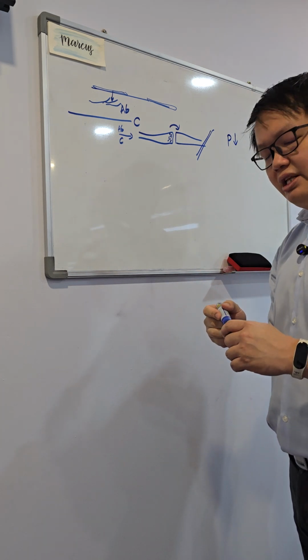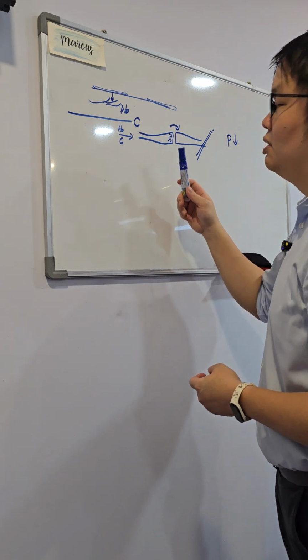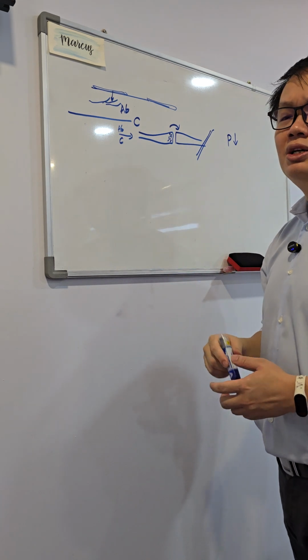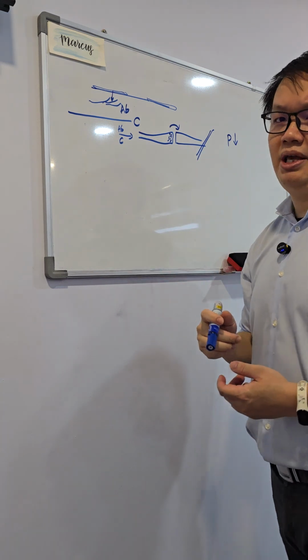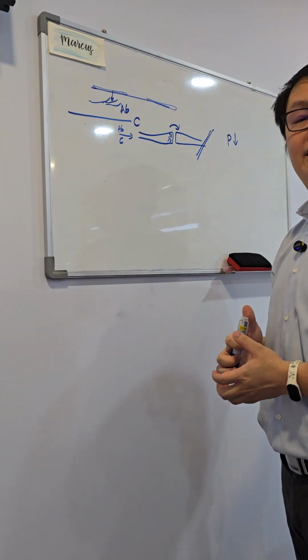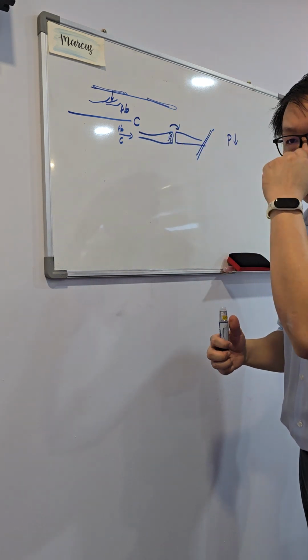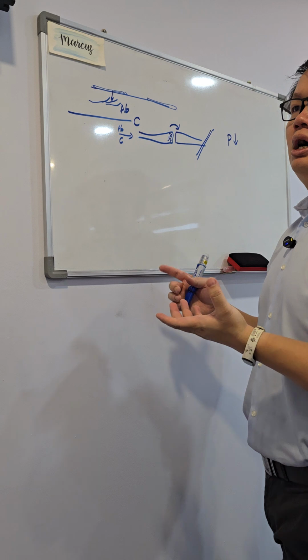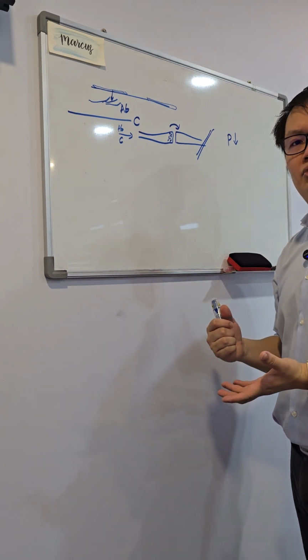However, the downside is that within 15-30 minutes, our body secretes new chemicals again, and then they will start feeling the pain again. Is it important for us to have it? I think yes. I think it is still important for us to recognize that this is a harmless and drug-free approach to provide pain relief.